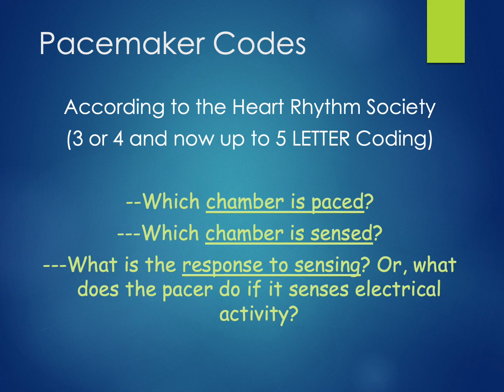For instance, the first letter will tell us which chamber is paced. The second letter will tell us which chamber is sensed. The third will tell us the response to sensing. The fourth will talk about rate modulation. The fifth will talk about multi-site pacing.